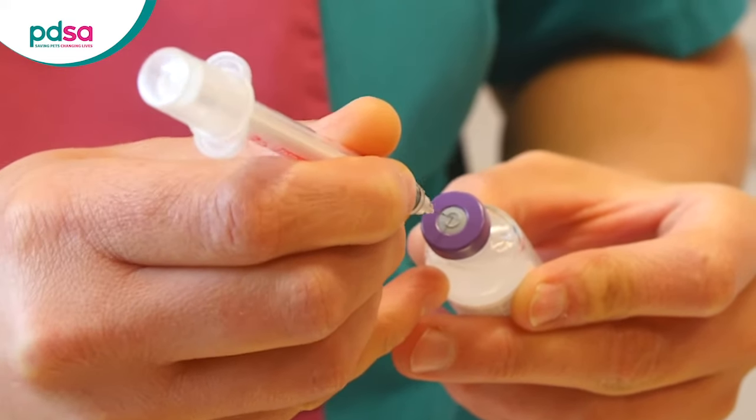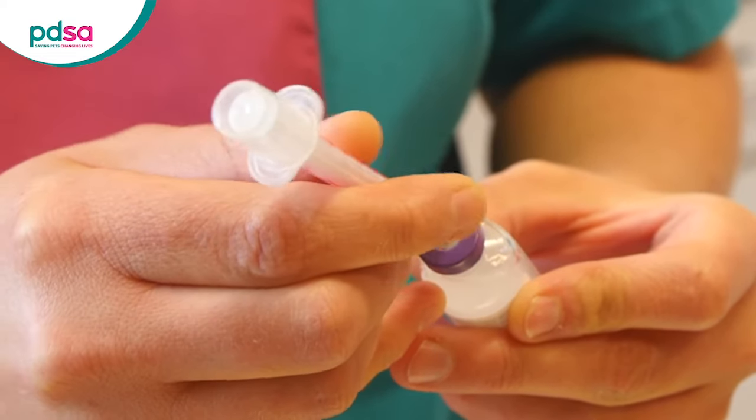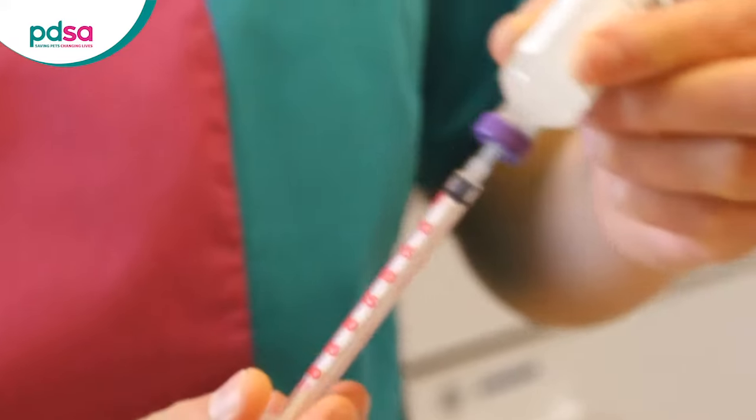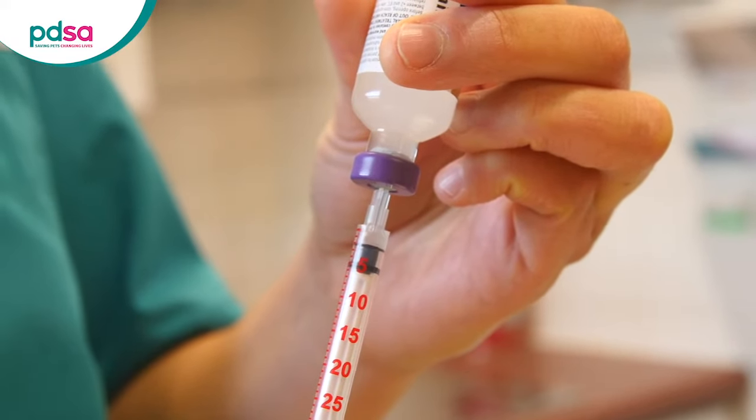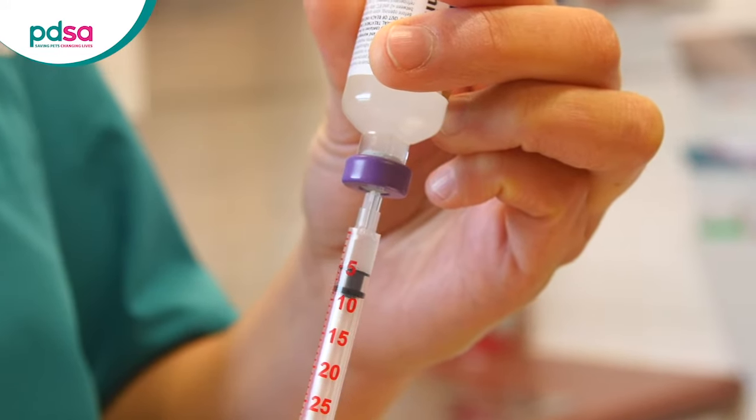Carefully put the needle of the syringe into the rubber top of the insulin bottle and keep them both upright. Draw back the plunger so that you have slightly more units than your pet needs.